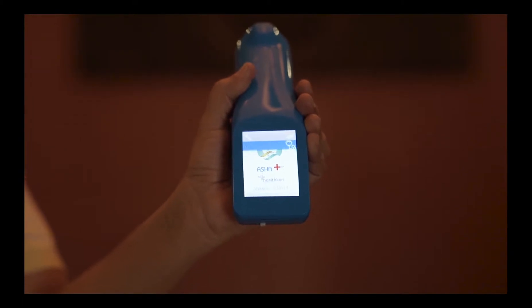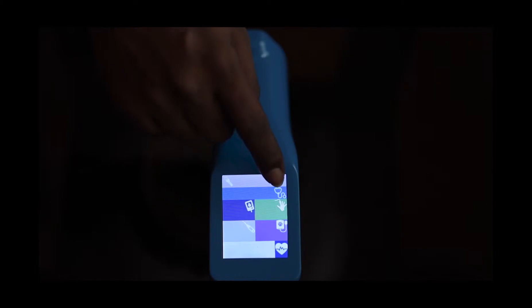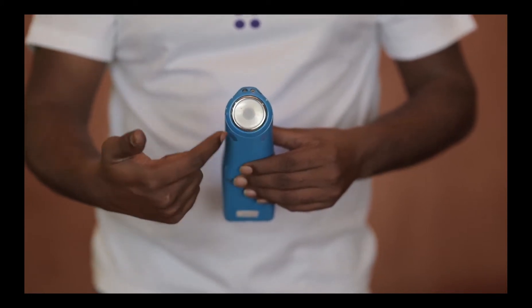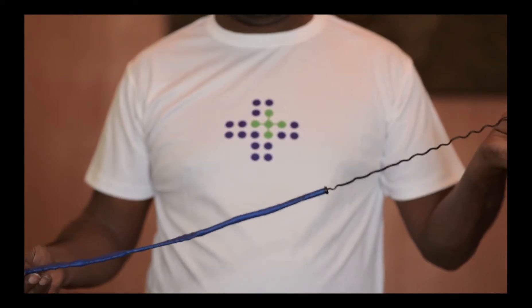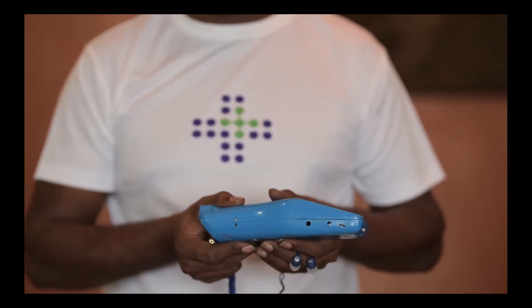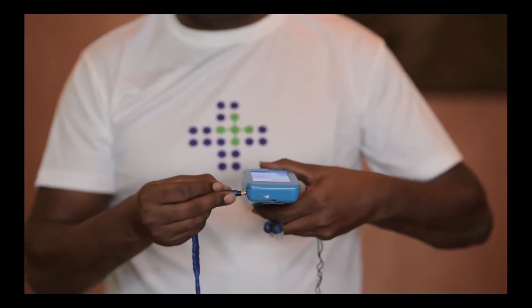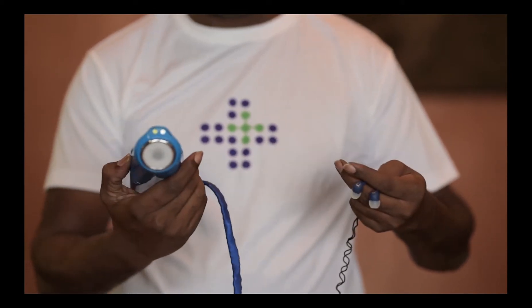This device needs to be switched on for starting the operation. We're going to be starting with auscultation. Auscultation is measured by the diaphragm as shown in the video. The headphones connect to the ASHA Plus device for the healthcare supervisor to monitor the heart and lung sounds. It is inserted as shown in the port. We are now ready to measure the heart and lung sounds.